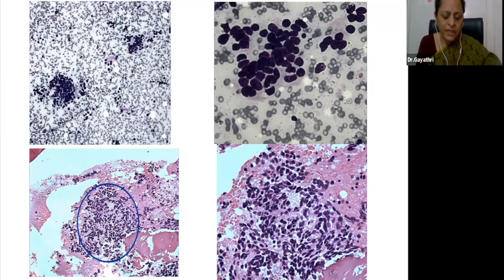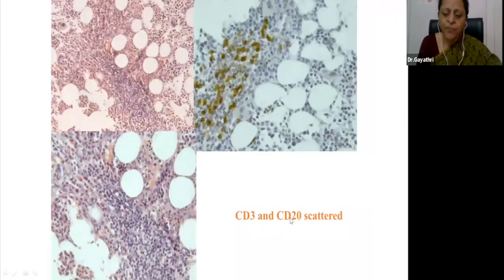And this is how this case would look. This focus that is circled here of metastatic round cells, they show a slight tendency to spindling, unlike lymphocytes. So that's how we differentiate them from lymphoid cells in the marrow histology.